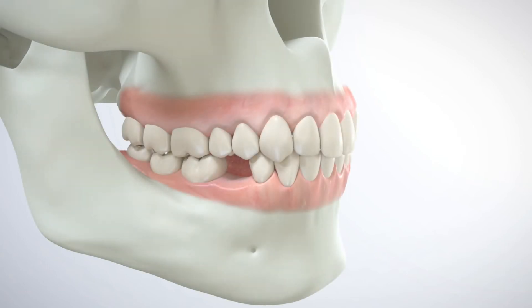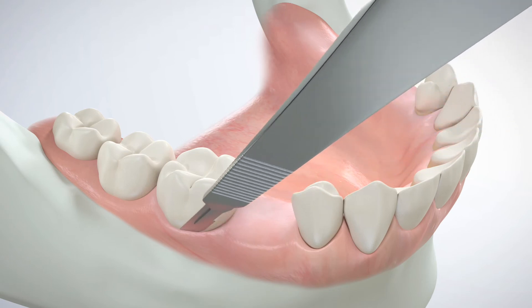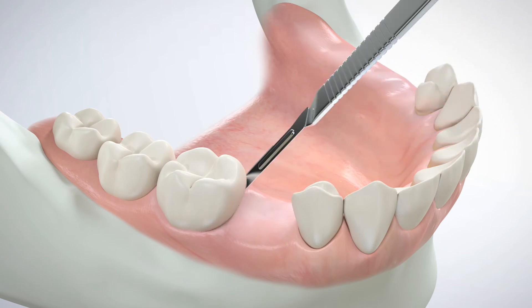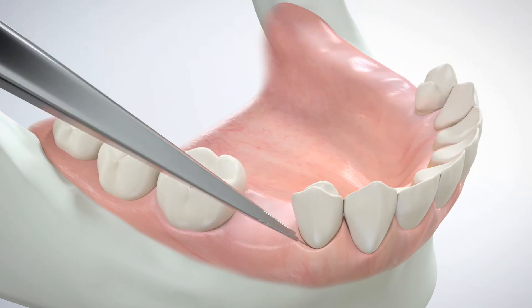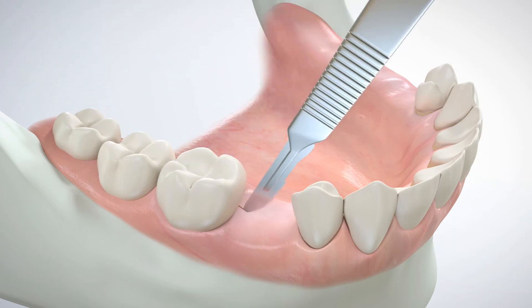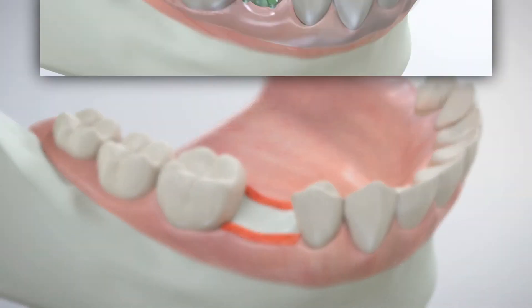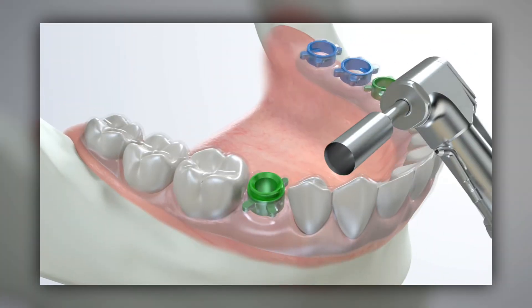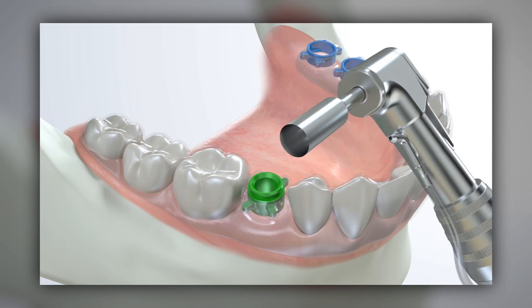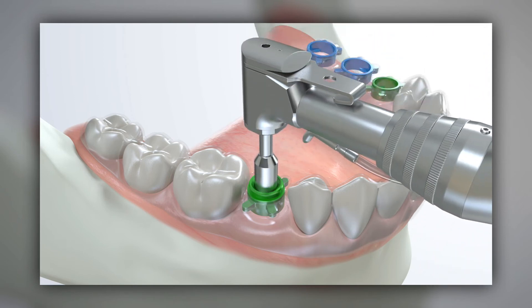We will now demonstrate a surgical dental implant procedure using the GRS guide system. Using a scalpel, the edentulous site is prepared with a full thickness periodontal flap. As an alternative to a full thickness periodontal flap procedure, a tissue punch may be used for initial access to the osteotomy site.